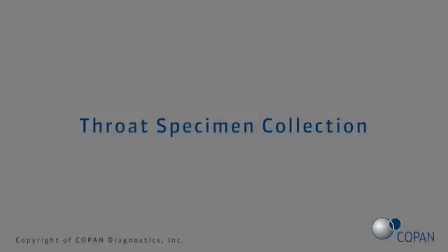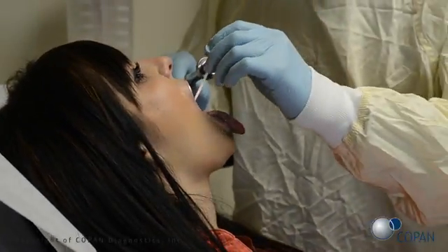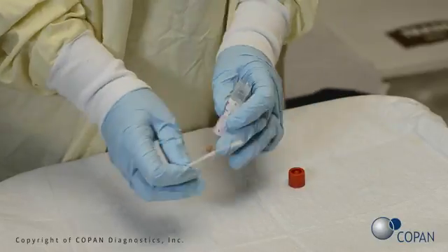Gently remove the swab and perform the test according to the manufacturer's instructions. Next, to collect the throat specimen, instruct the patient to tilt their head back. Rub the swab up and down against the back of the throat, avoiding the tongue and cheeks. Gently remove the swab and perform the test according to the manufacturer's instructions.